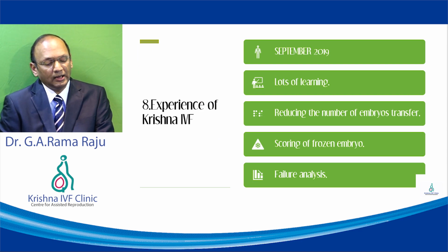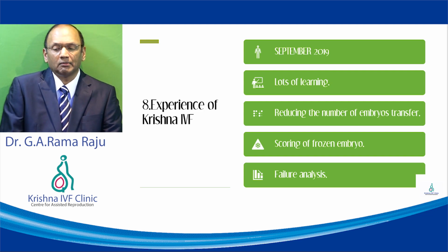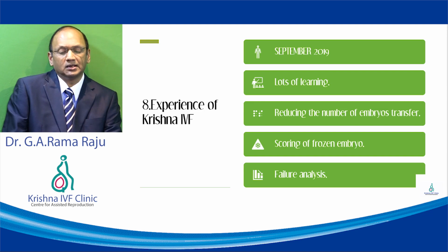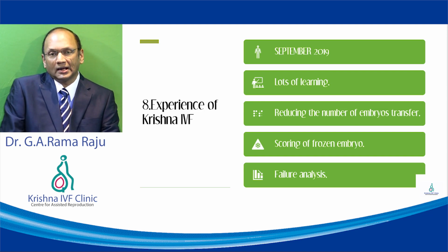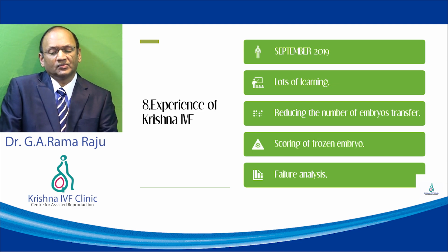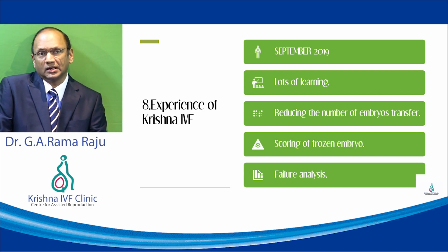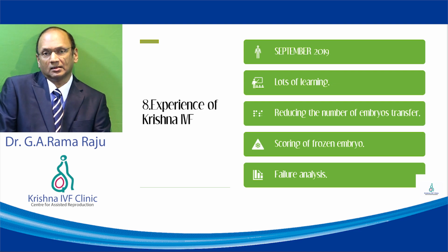And when we look at our experience, we started using time-lapse from September 2019. Our whole understanding of embryology has changed. We are able to reduce the number of embryos that are transferred, and we are also scoring the embryos which we are freezing, so that we are able to transfer embryos which have better morphokinetic parameters, so that implantation is better.